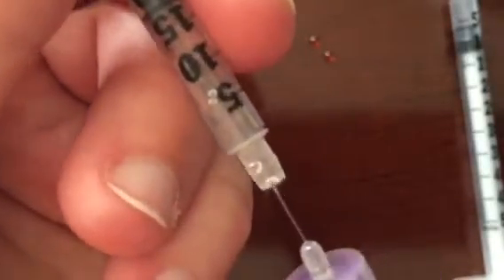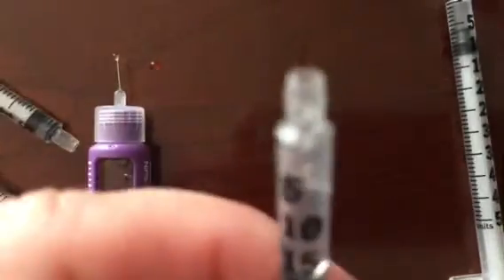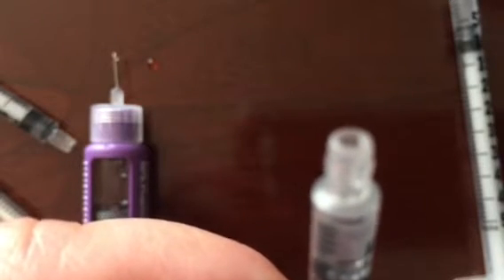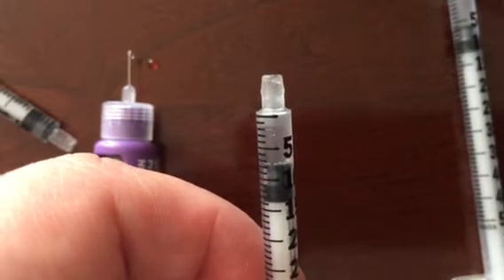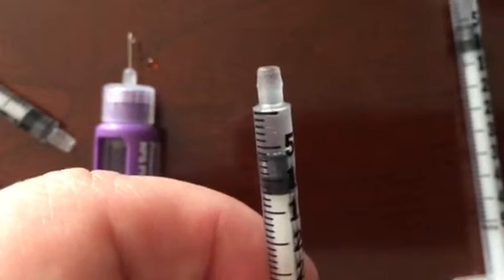All right, dialed it in to go. Inject my medicine. Make sure to get it all. Tap out the air. Push the air to the top. Oh, big air bubble there at the bottom. So there. Air out. Right there. And this one measures 7.